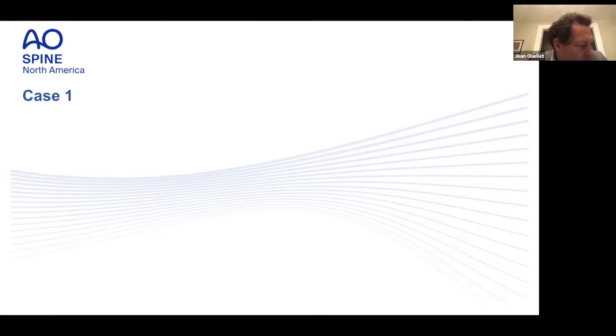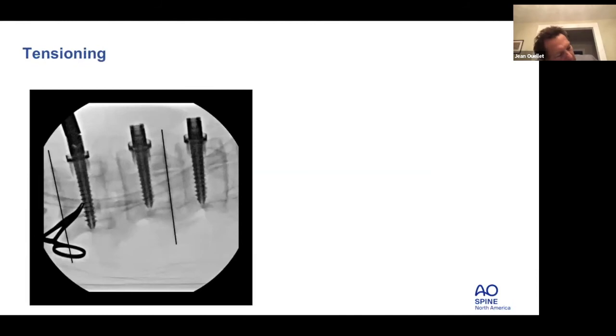how much to tension. So obviously, we heard Stefan across the thoracic spine, you're really loading the apex and trying to get things parallel. And then, in your lumbar, Neil, you've seen that if you do that, you get into trouble. So I'm not sure if people understood. So at least for me to better understand, you tighten all your cable down to the tension that you think, and then you actually test to see how you think that system is going to behave in a so-called semi-loaded upright position by seeing how much that's going to bend. Is that what you're doing?